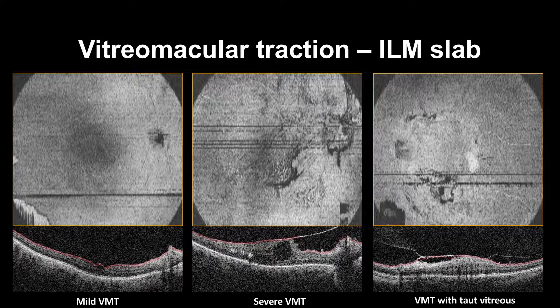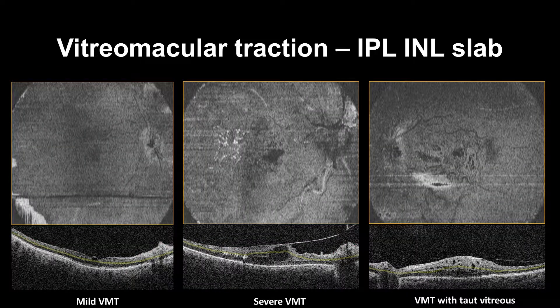In cases of vitreomacular traction, the ILM slab in mild cases will show no significant changes to a small hyperreflective circle. However, in more advanced cases, the vitreomacular traction will appear as curved hyperreflective folds directed to the adhesion, which appear as a cluster of hyperreflective folds. In cases of taut vitreous, the ILM slab will show a membrane-like adhesion. Please note the blink artifact. The IPL-INL slab will show hyporeflective circular changes in vitreomacular traction cases inducing intraretinal cystic changes.